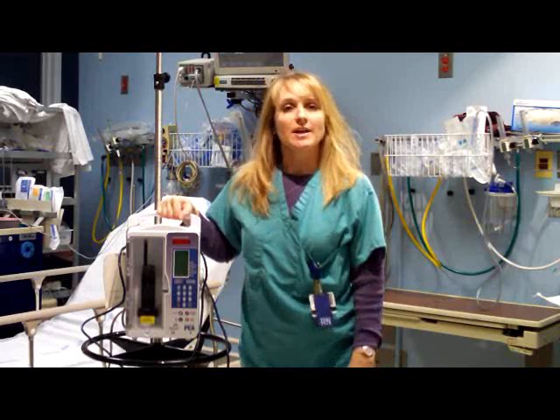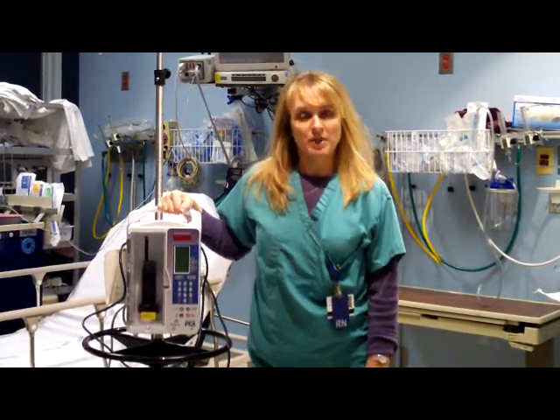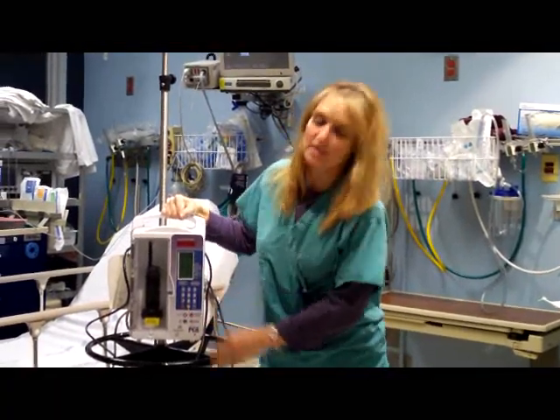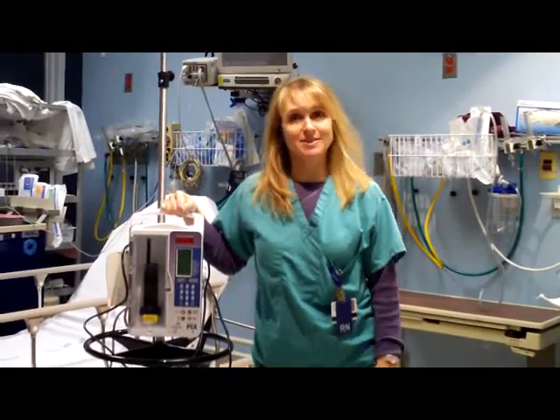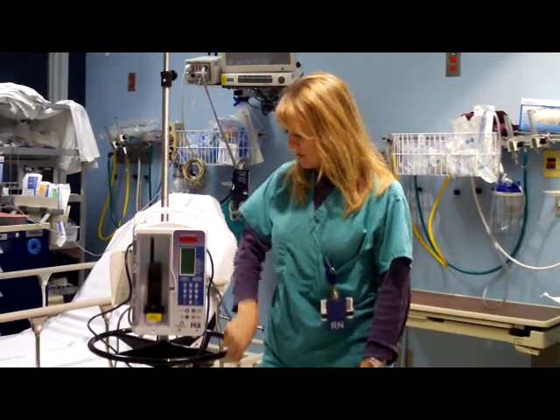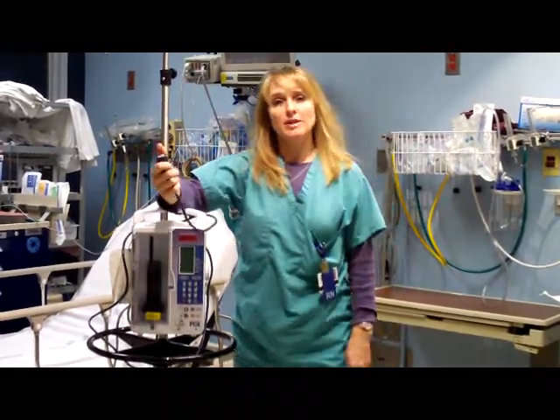Then another clinician has to come and they have to check the patient and the orders and check it against what's programmed in the PCA. Once that is done, you can hand the patient their button and they can start their pain management.